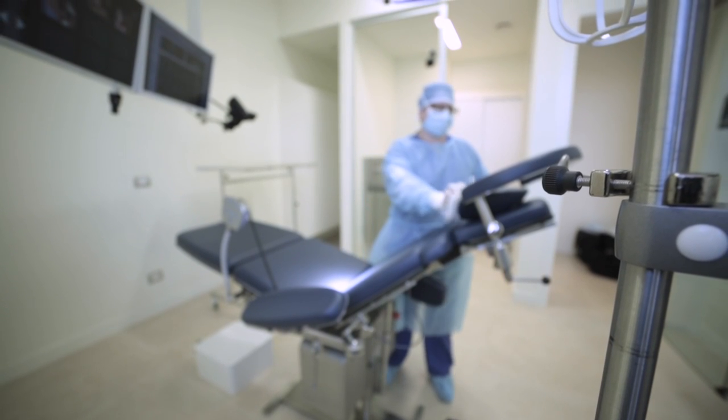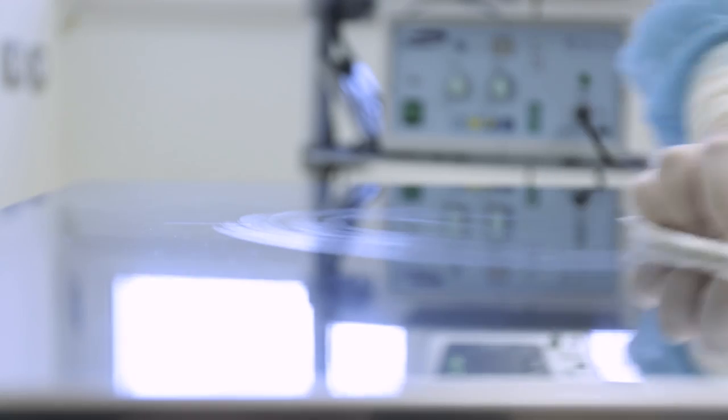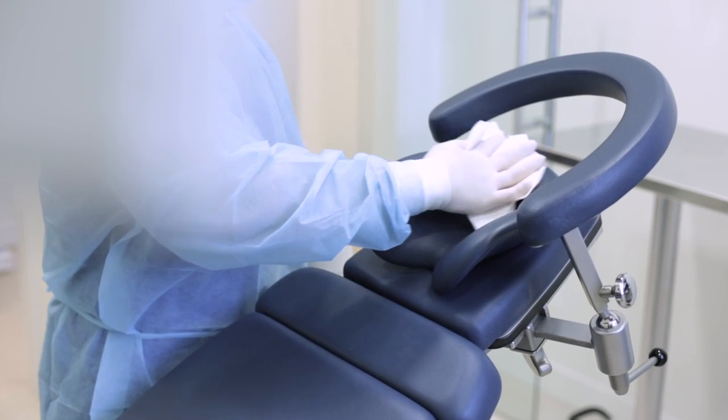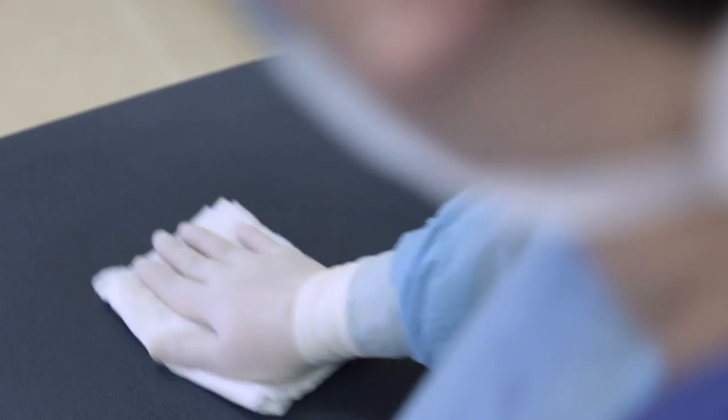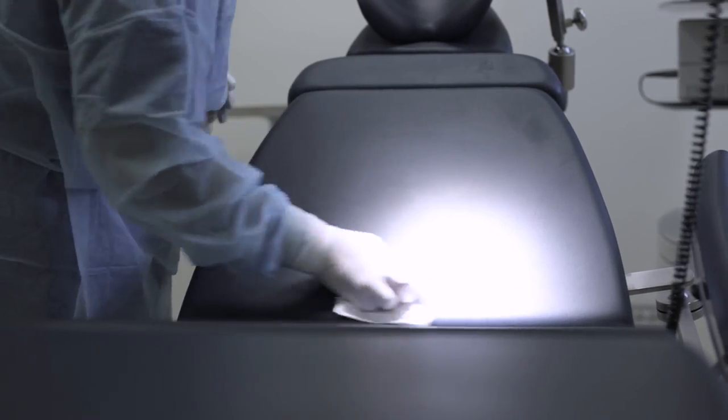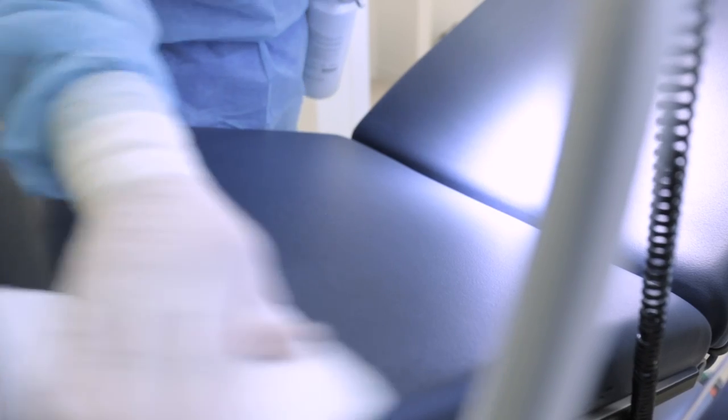Start with the disinfection of all surfaces, paying particular attention to the main tables. Surfaces must be decontaminated by spraying disinfectant onto a paper towel, starting from the centre and working outwards using a circular motion, without ever going back over previously cleaned areas.